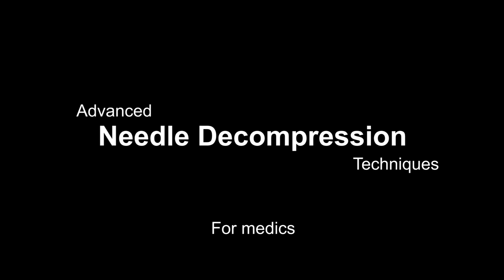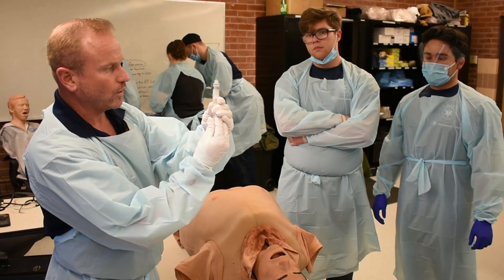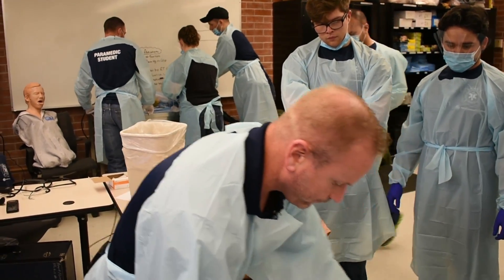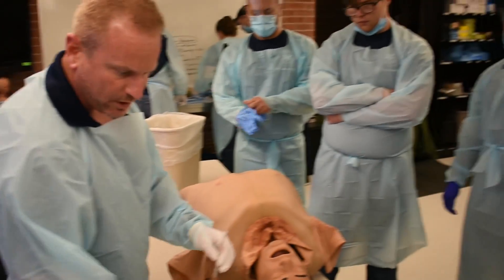Needle decompression. There's a few ways to needle decompress. However, if you're in flight, if you're in a very noisy environment — how I have it set up, even in my civilian bag, is I have two needles.